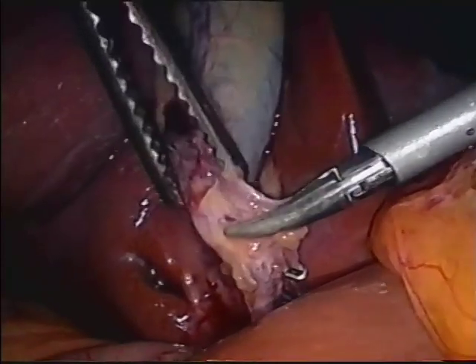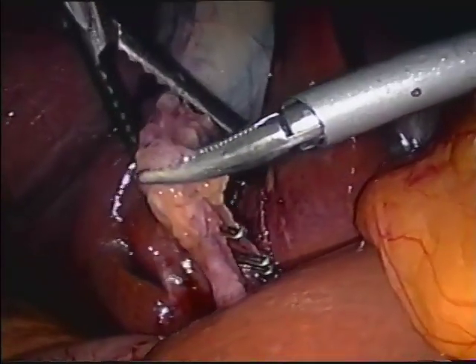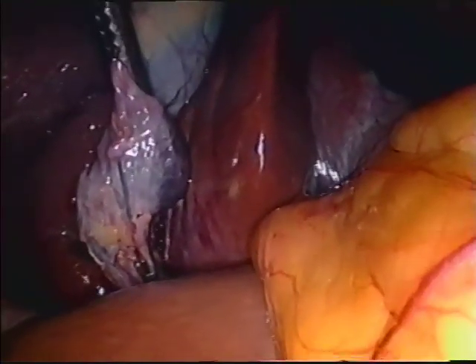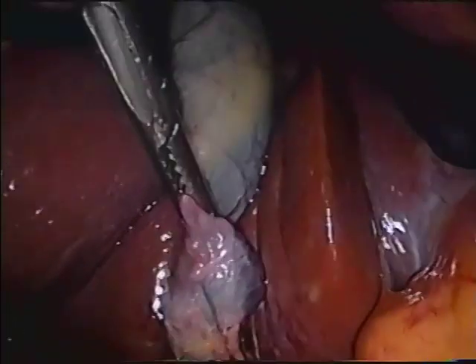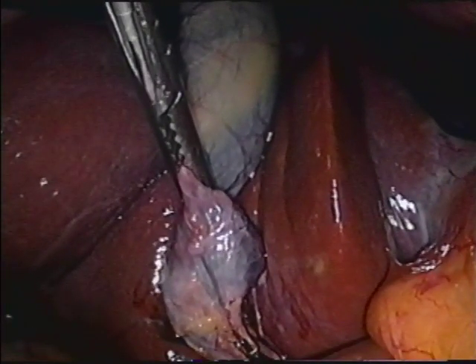The clamp is then reapplied for cholangiography. The jaws are 4cm long and extend completely across the neck of the gallbladder just above the Hartman's pouch. Care is taken to avoid injury to the lower surface of the liver from the tips of the clamp jaws.